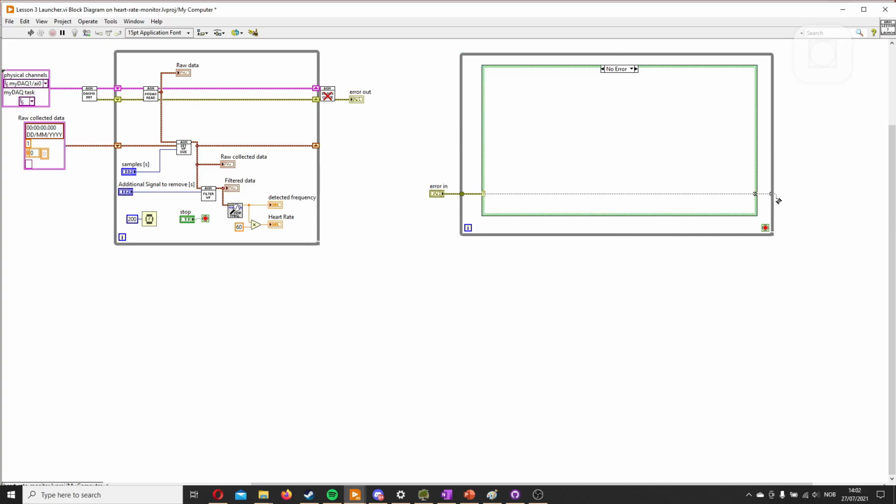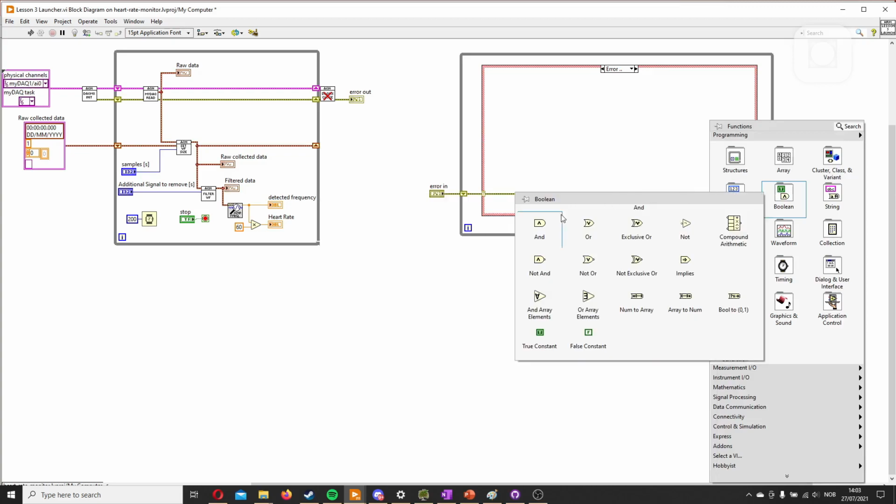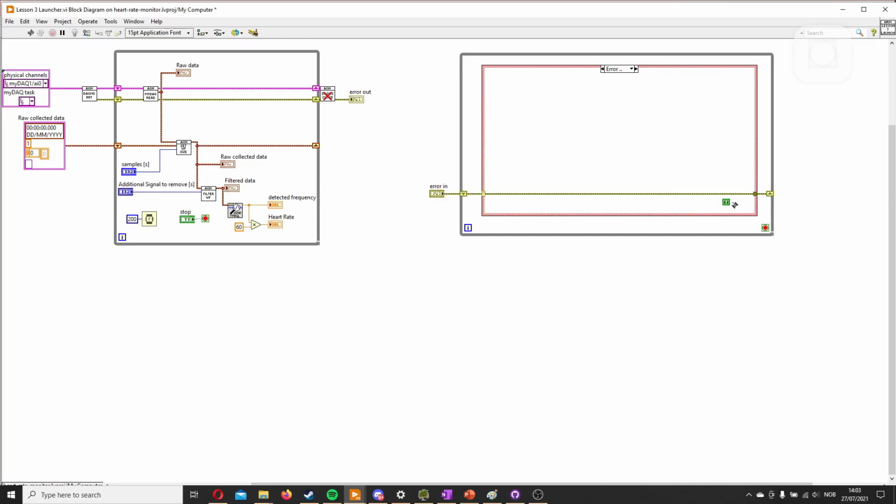And we'll let this one run like this, and we'll add a shift register to it. Select there. This will loop the data, and you will soon see why this is nice. When this is running, if there is an error in any of the main code here, it will automatically go into this loop. And in here, we can just have a boolean that's true that goes here. And in the other one, we'll have the controller, but I'll move it over soon. The point is that if there ever is an error, it will stop.